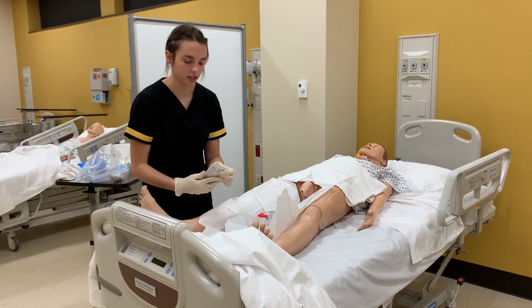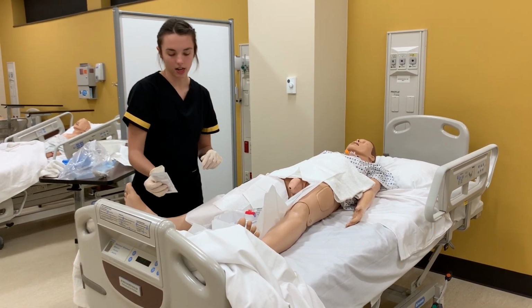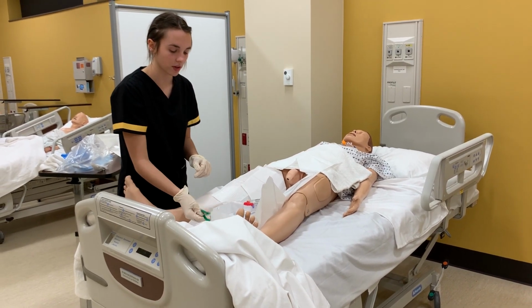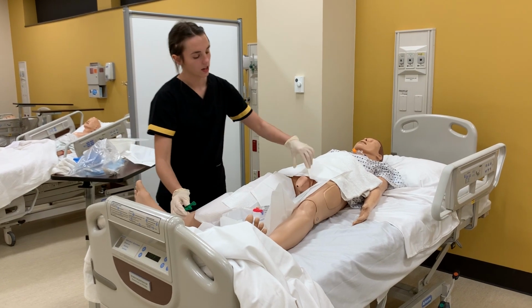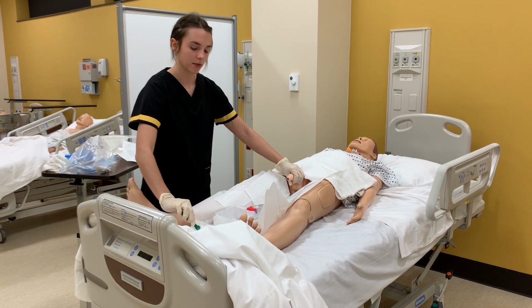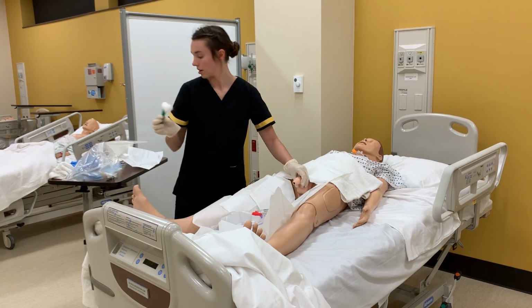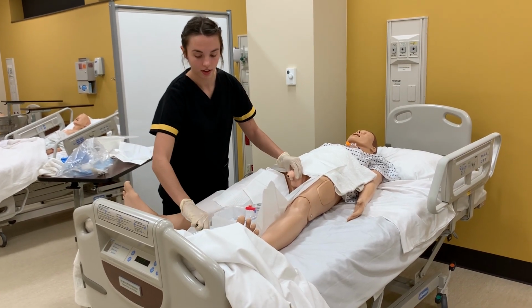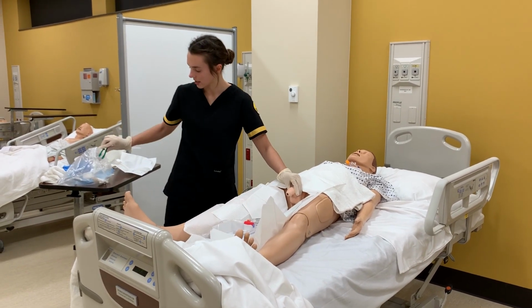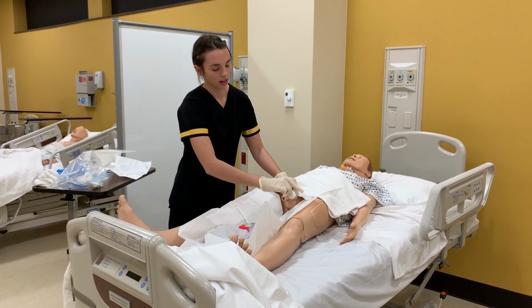Okay, so this is our betadine that we're going to use to sterilely clean. So I would put it on my cotton balls and toss that as well. And now we are ready to start. So I would grab, and now that I've grabbed the penis, I cannot move this hand. So I would grab our betadine, go around the shaft, toss it, go around one more time, and toss it, and one more time, and there we go.